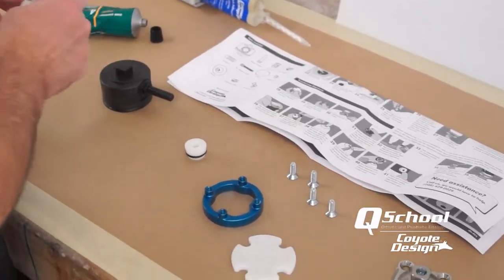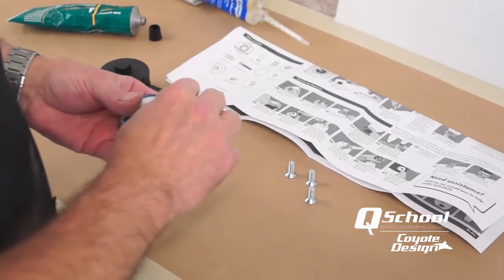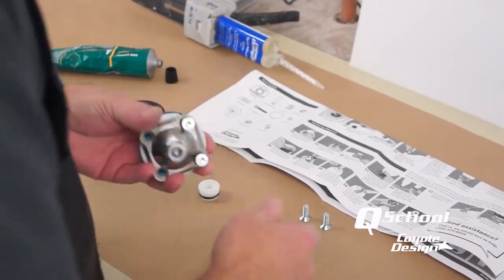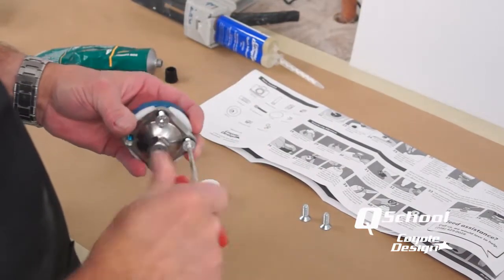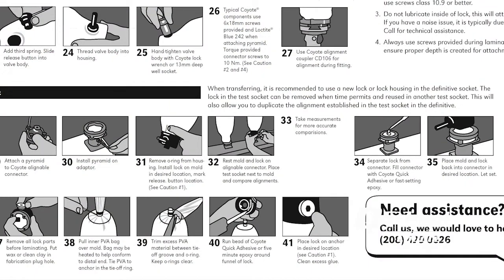It keeps you from prying on things after you have it all glued together on your cast. Put our pyramid on — these are the four screws that are provided, they should be M6 by 18. You will find that 20s are too long; the chamber for our connectors is designed to hold an 18mm screw. Then in our instructions it shows taking the lock and placing it on the end of the cast and setting it down into your alignment and gluing it into place.